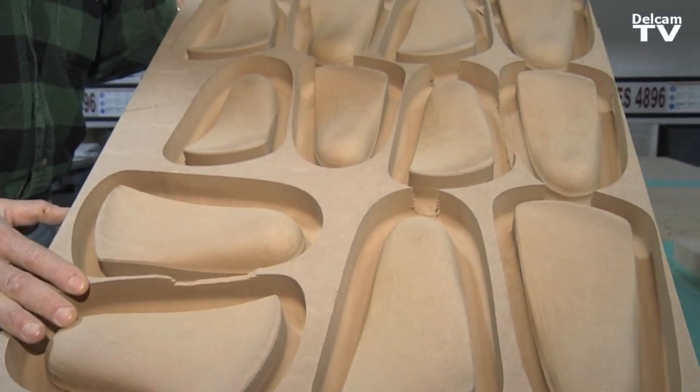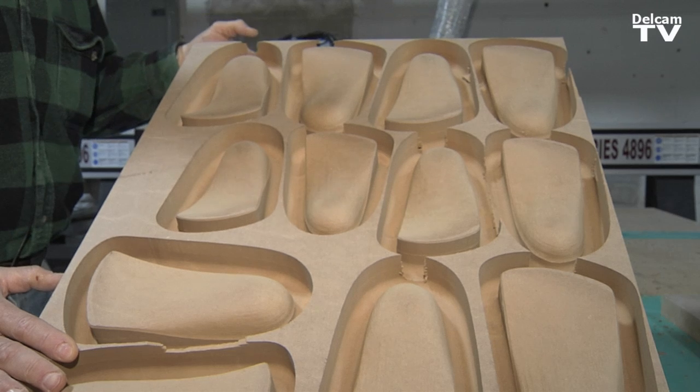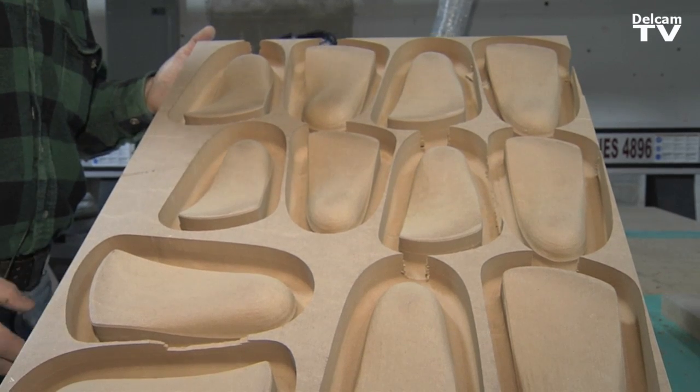The finished product — nice and clean. All we've got to do now is knock these out. They'll be ready for production.